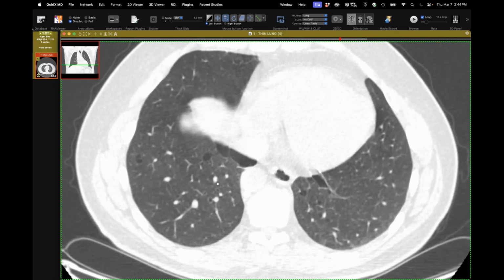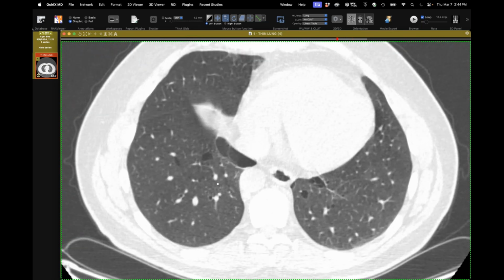And it's important. The previous imaging had been done elsewhere, and it had not been commented upon. I think it's important because of screening of family members, because they're at risk of renal cell cancers. So I think they're still recommending annual ultrasound in asymptomatic patients. So have a low threshold.